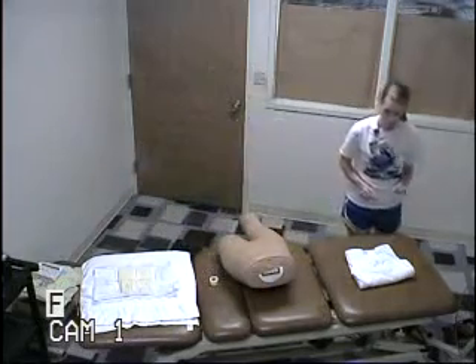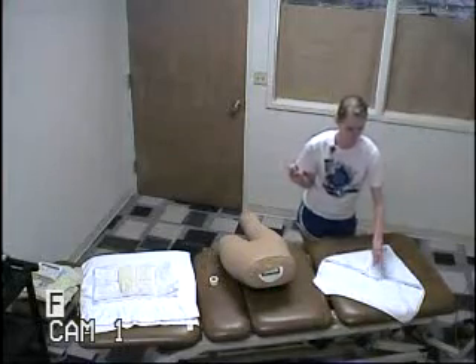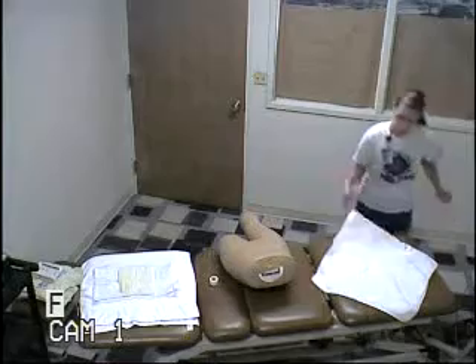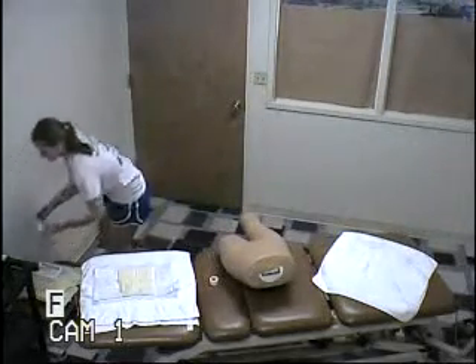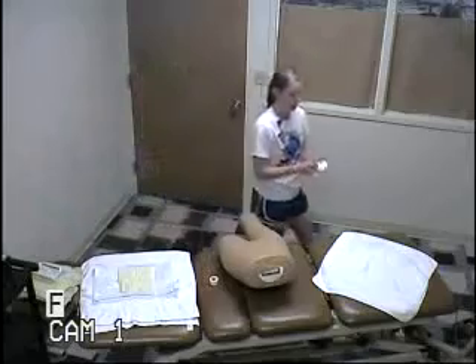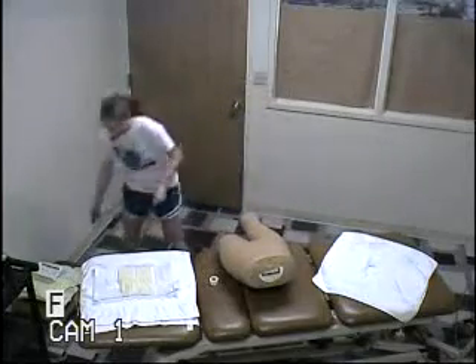And then I'm going to open my sterile field. Pinch. Pinch. And I'm going to get my two-by-twos. Open my two-by-twos. Dispose of that.